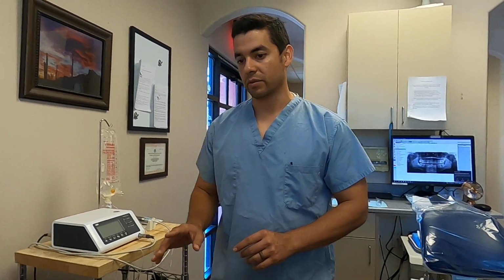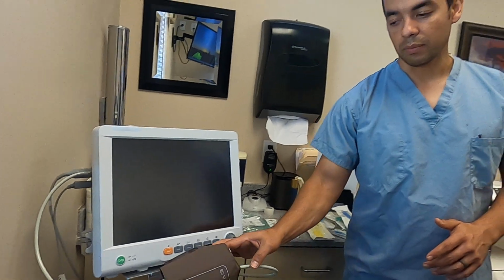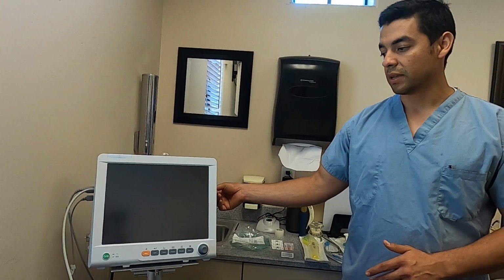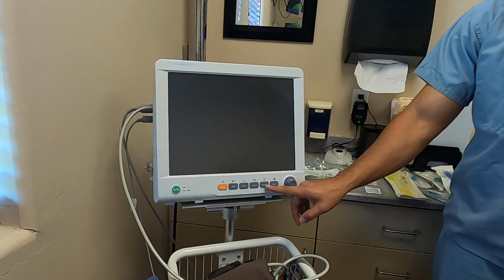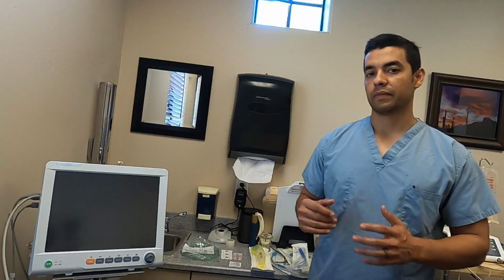One thing that I forgot to mention, when we have the patient hooked up to the anesthesia monitor and we've taken a blood pressure, the machine will automatically start to print out the vitals. At the beginning of the procedure, before we start, we want to press the record button here. This button, when it's pressed, will print out on that paper their current heart rhythm, and that's important to have for documentation.